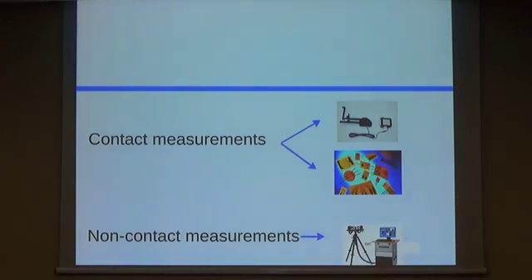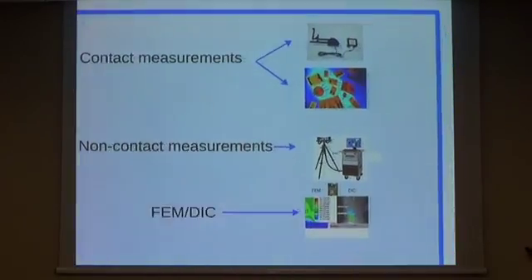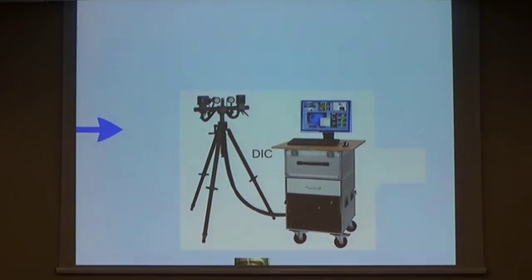For this research we use the non-contact optical, material independent method known as digital image correlation for determining strain on different surfaces of the block.